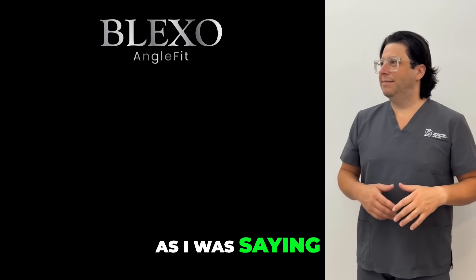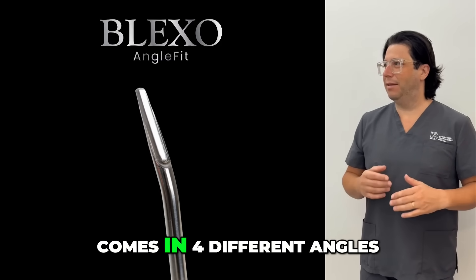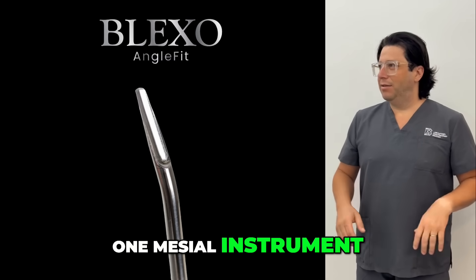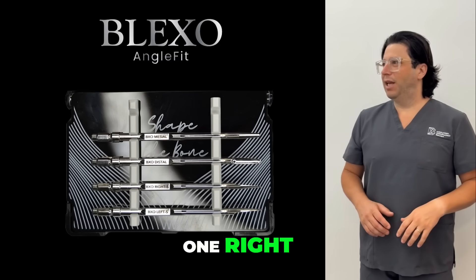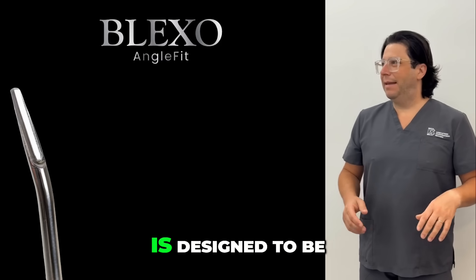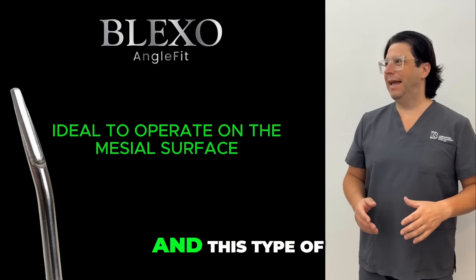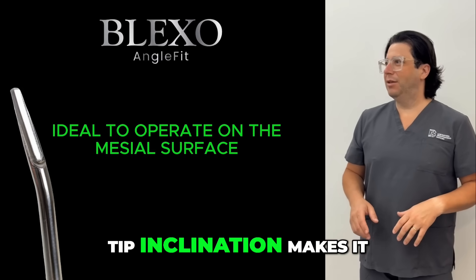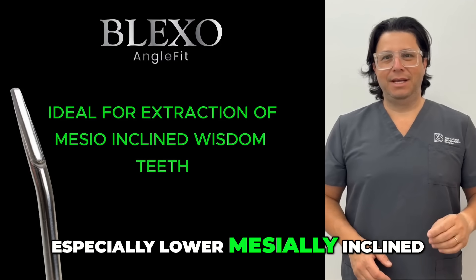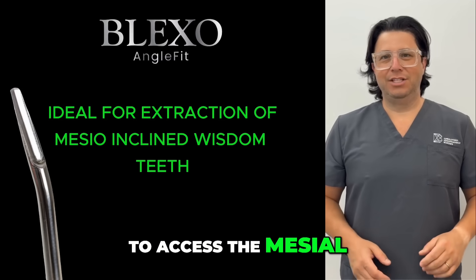There are four different tip angulations — the tip itself is the same but comes in four different angles. Specifically, we identify one mesial instrument, one distal, one right, and one left. The mesial AngleFit is designed to be applied to the mesial surface of dental elements, and this tip inclination makes it particularly suitable for extracting wisdom teeth, especially lower mesially inclined wisdom teeth, where it is easier to access the mesial surface of the tooth.